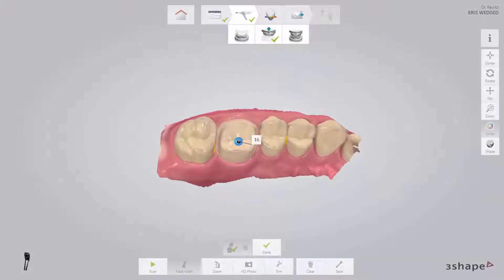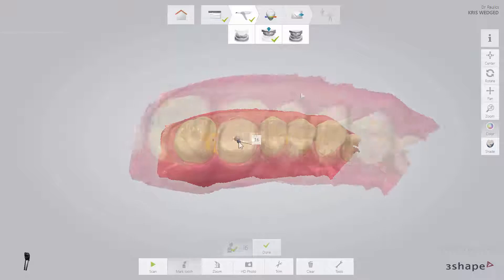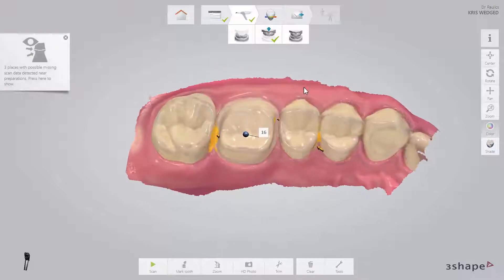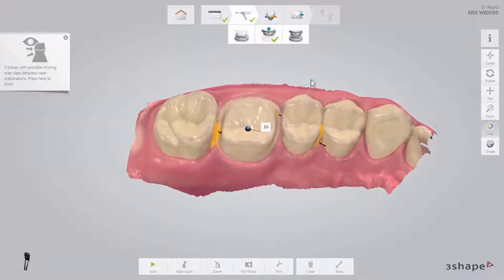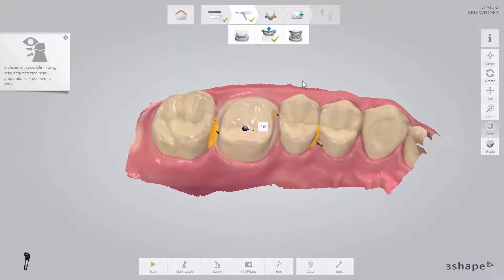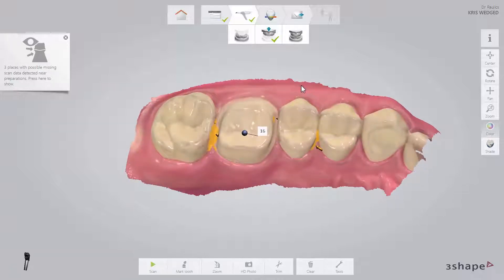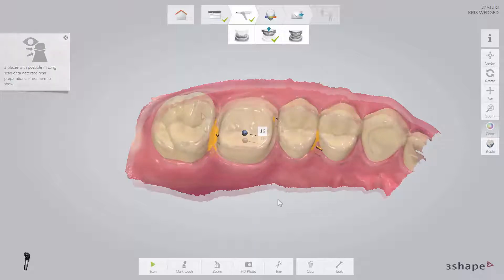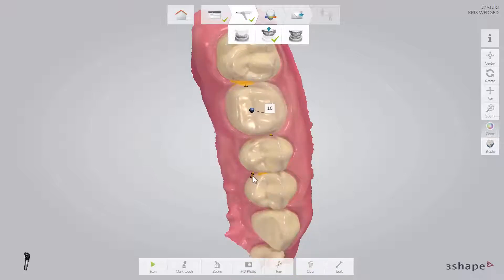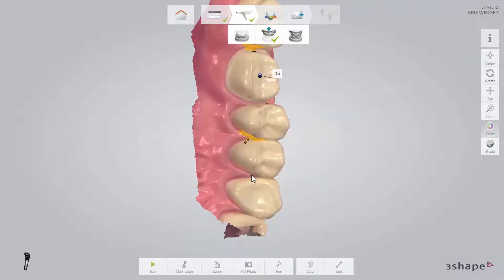If any holes are found, you will be informed by a pop-up. Pressing the pop-up will rotate the scan to show the areas not scanned, indicated by amber arrows. If the holes are located at critical areas such as the preparation, margin line, or contact points, you will need to add some scanning there. Otherwise, no further scanning is required.